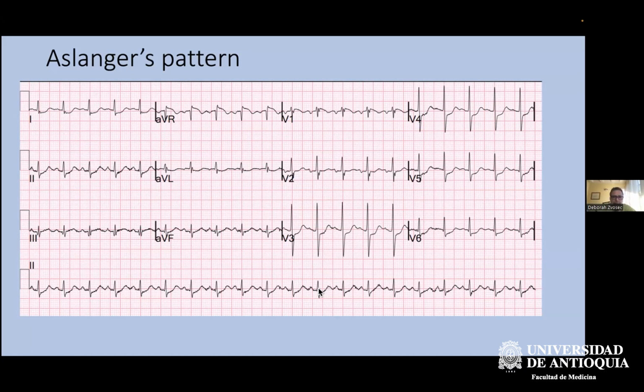Yes. So I have long hypothesized that what makes me recognize a hyperacute T wave is mostly its area under the curve relative to the size of the QRS. Now, that's how I've taught this AI system. I was the one who taught this AI system. And so it kind of mimics my brain.